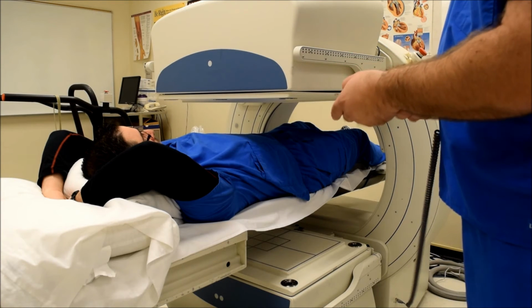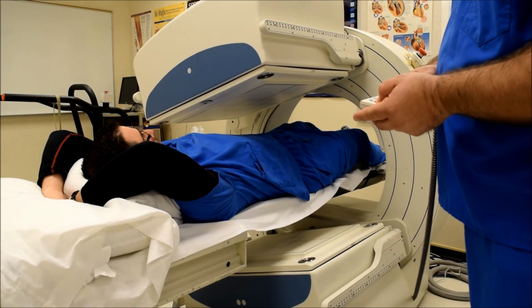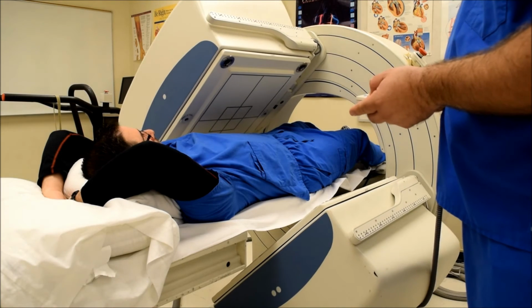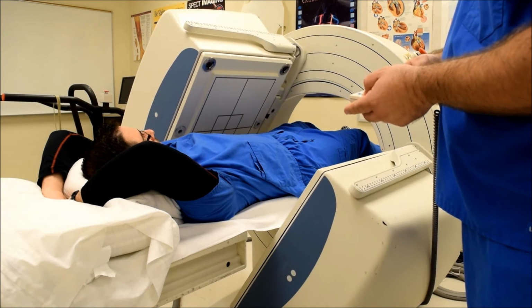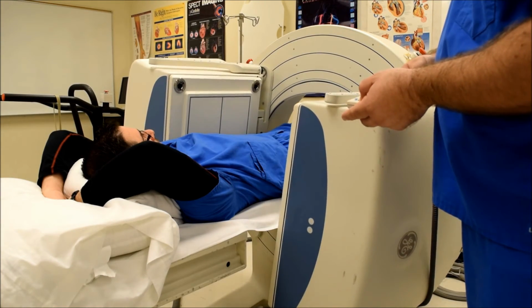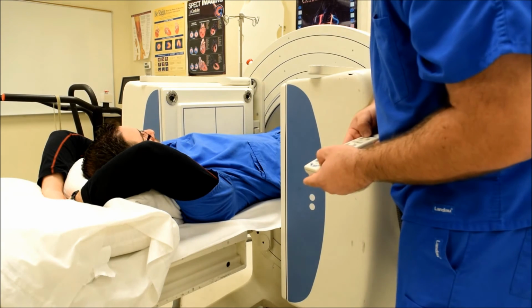The best way to do that is to spin the camera to the sides to make sure you have clearance on the sides of the patient table. So it looks like our clearance is pretty good there. We can probably bring them in just a little bit.